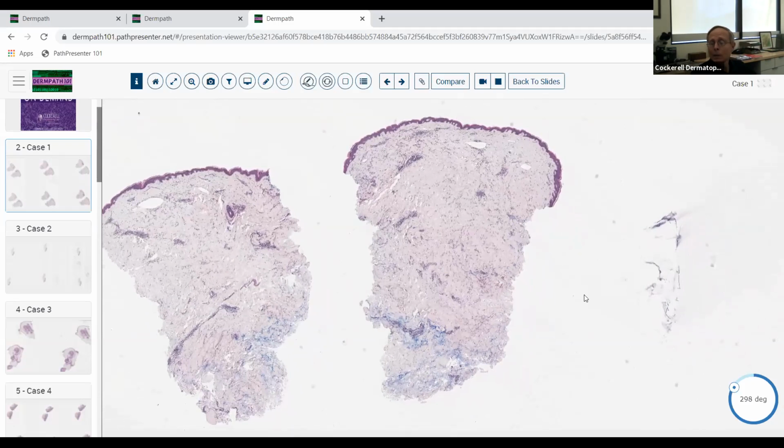I would recommend that when you're doing this on your own, you do test yourself and do this like we do it under the microscope here. We look at everything without any information. We apply the criteria. We come up with a differential diagnosis, and then we correlate that with clinical information and try to make a final diagnosis.